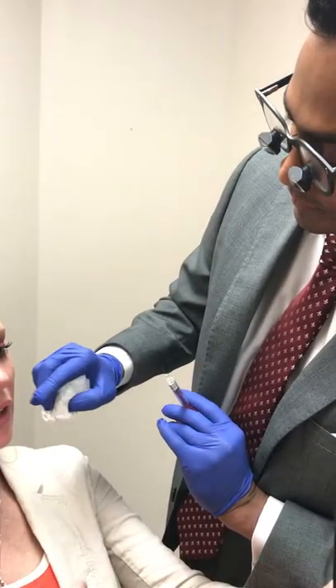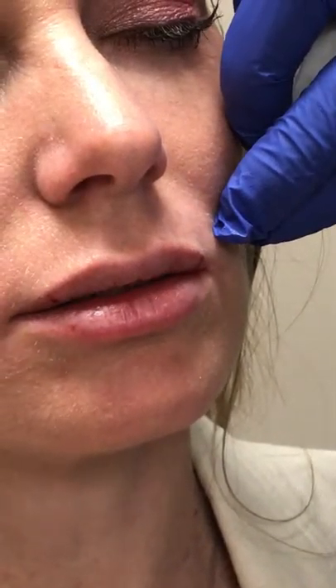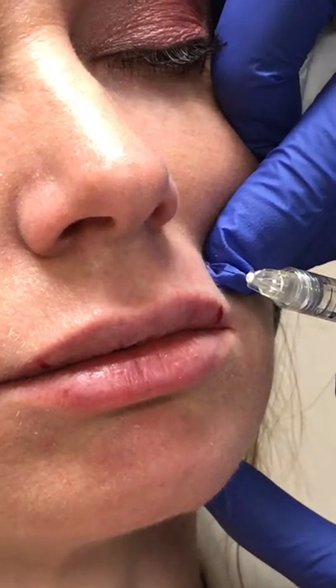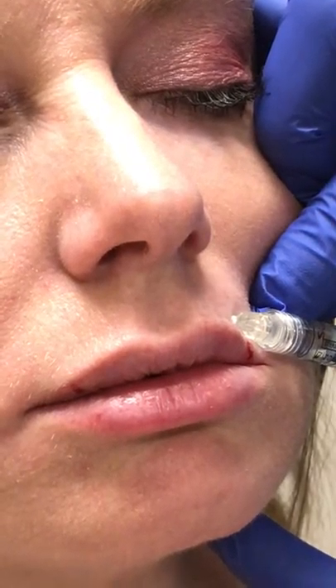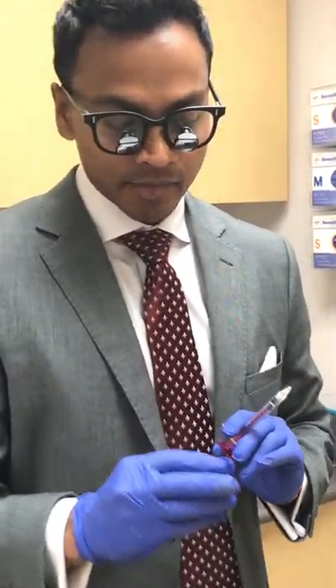I'm going to go up there just a little bit — it's going to be a little more sensitive. How did you do with the other ones? Just the prick hurts and then I didn't feel anything after the needle was in. This is going to be a little sensitive — one, two, three. When you inject in that upper lip area, you don't want to go crazy with the volume because it can actually make the person look more duck-lipped, so you have to be a little careful with that.